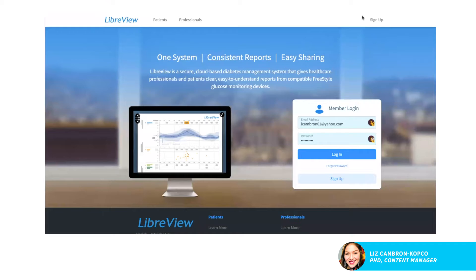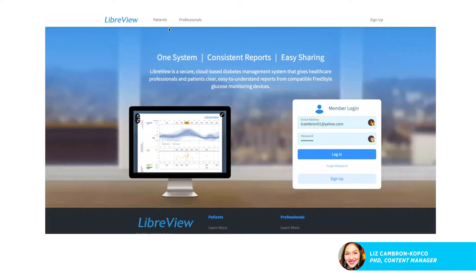Today we'll be talking about LibreView. This is the desktop app that comes with your Freestyle Libre, which is your continuous glucose monitor from Abbott that reads your blood glucose level continuously. There is also a mobile app or a handheld monitor that pairs with it. We'll walk through the highlights of this online desktop so you can understand how to read your data and share it with your healthcare provider during appointments.